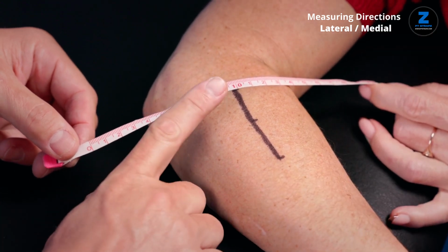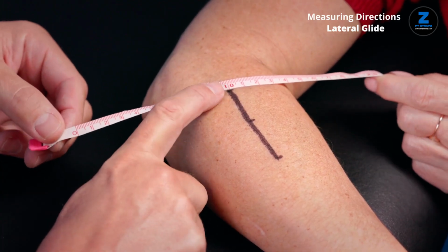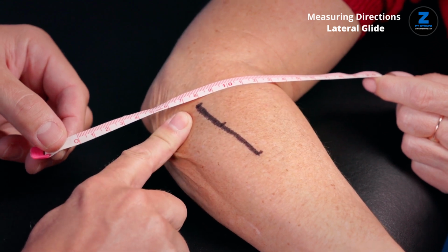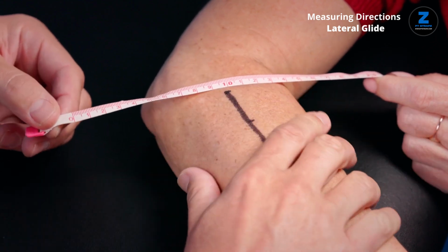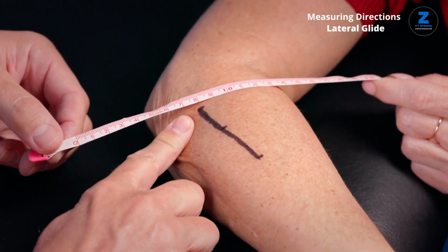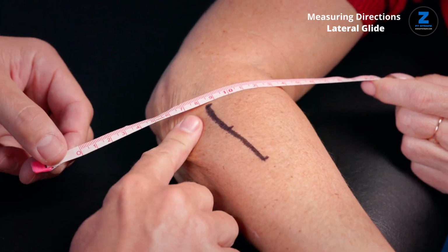So I'm going to hold, and then I'm just going to pull the skin over laterally to see how far the very superior aspect of the scar moves, and see how it simply pulls 2 centimeters over. All right, so from 10 to 8 to 2. So I would say that's a 2 centimeter lateral excursion.